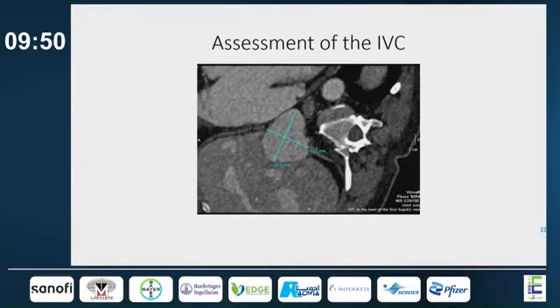Lastly, in the assessment, we have to know the perimeter and the mean arithmetic diameter of the inferior vena cava at the cavo-atrial junction and at the level of the first hepatic vein. Then we measure the distance in between if we think of caval valve implantation.